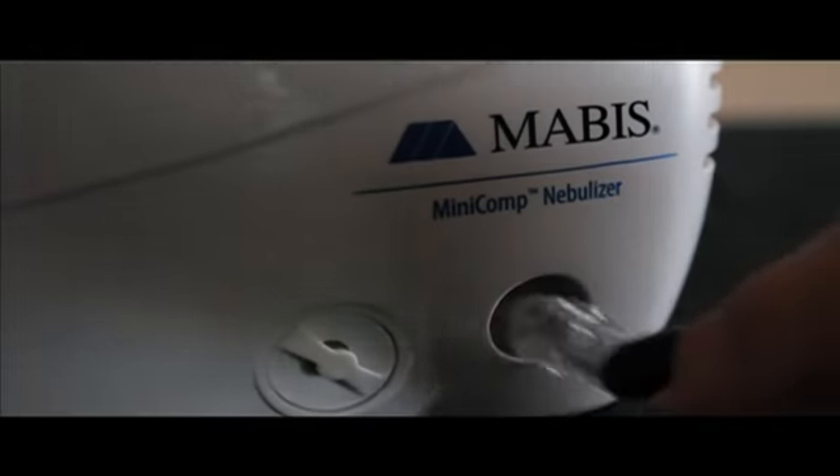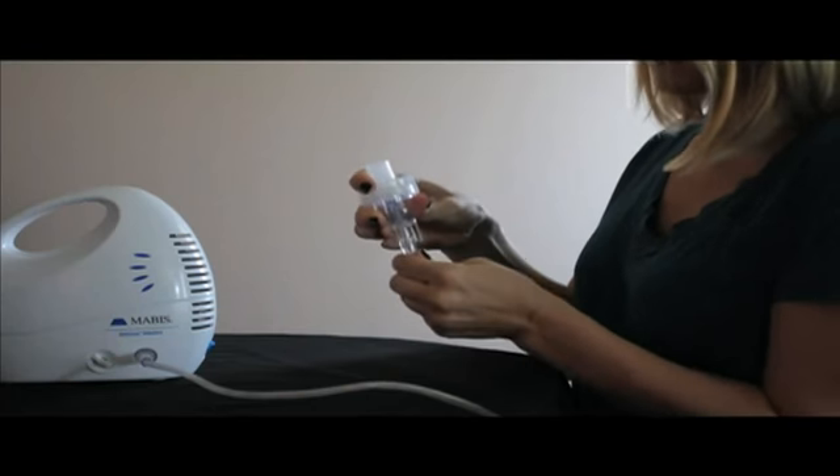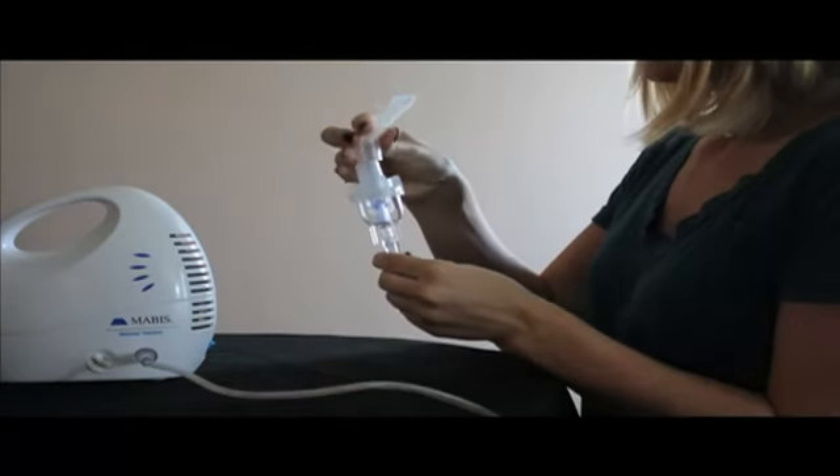Insert one end of the air tube to the air stem on the side of the unit. Carefully attach the opposite end of the air tube to the base of the nebulizer. Then attach the mouthpiece to the top of the nebulizer.